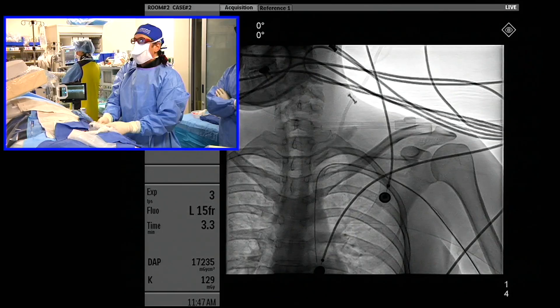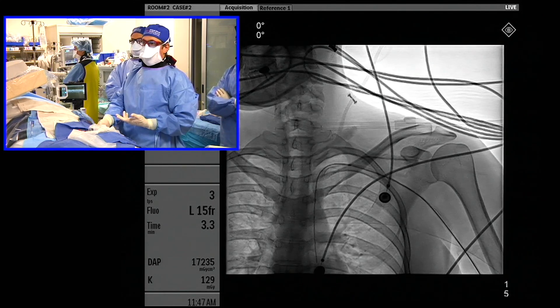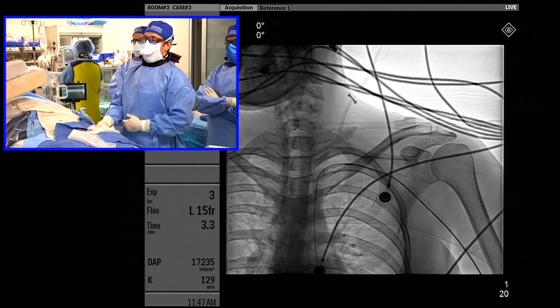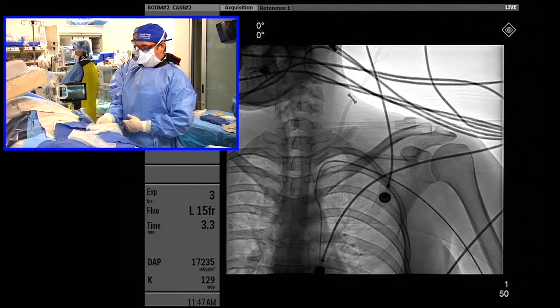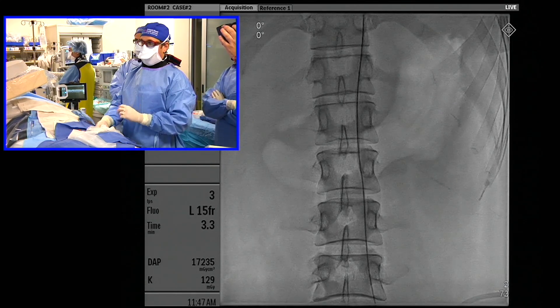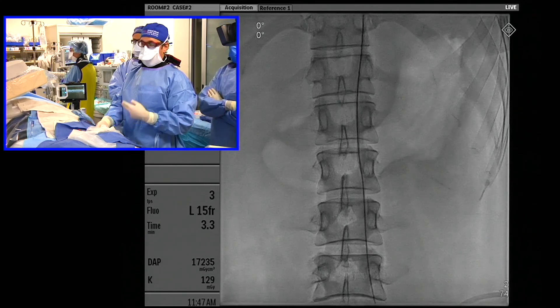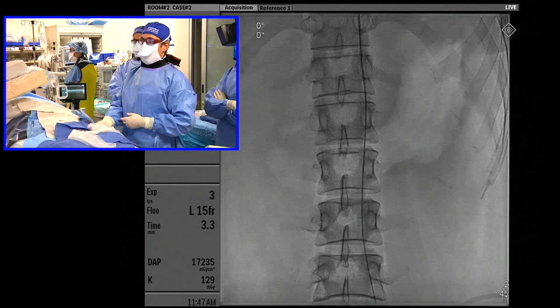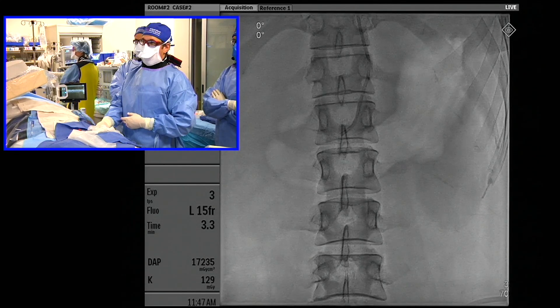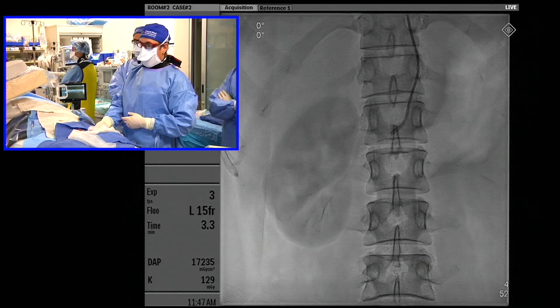Let's show the fluoro feed. The guide catheter came right down. Some people would say that with a 6 French guide catheter it may be challenging to navigate because there's a step-off — we used an 035 wire here. It wasn't an issue at all. This is hooked up to a second side flush, so it's continuously running saline. We came down over just a standard Benson wire and puffed directly into the renal artery without a wire. You can see how it snuck in pretty nicely — this was our first puff.